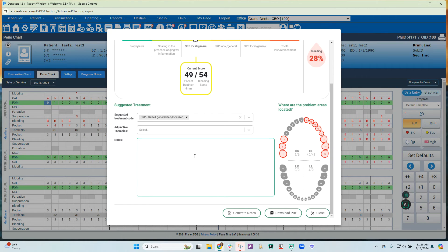Down here you can type home care instructions. We're also going to be setting up templates that you can use as a practice — you can design your own templates. I'm going to select generate notes, and these are AI-generated notes based on the stage above.